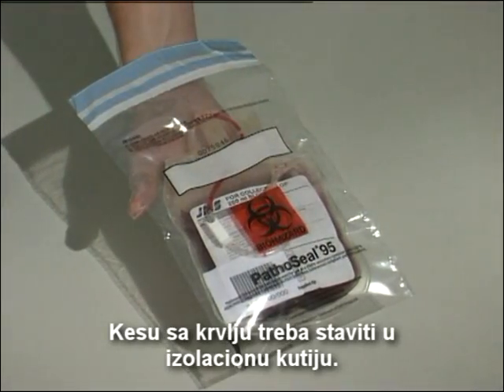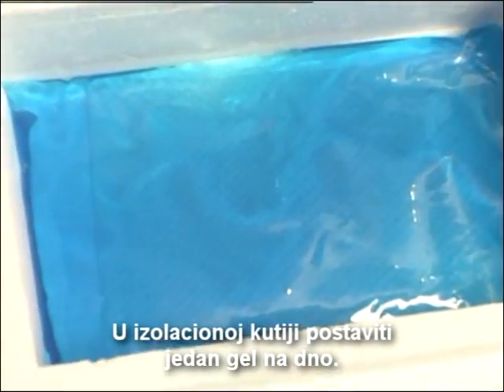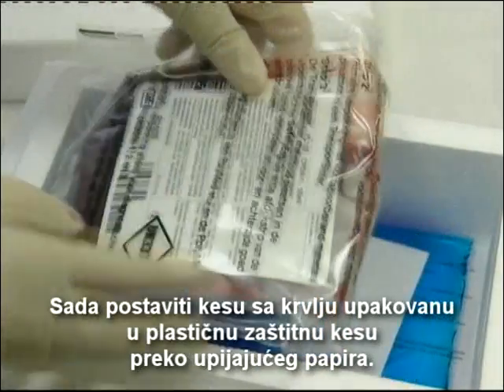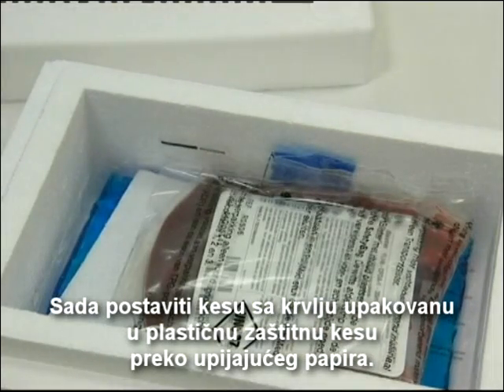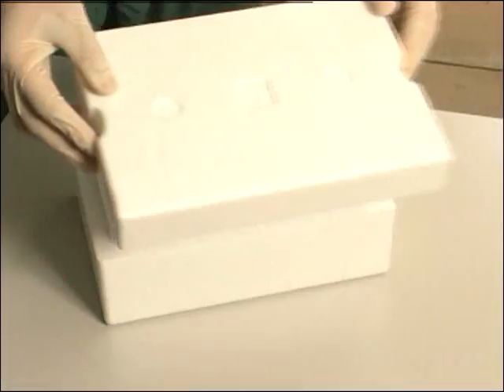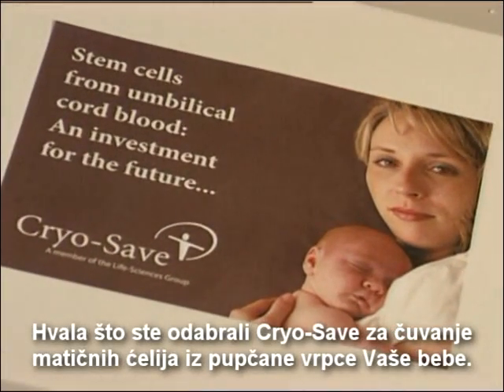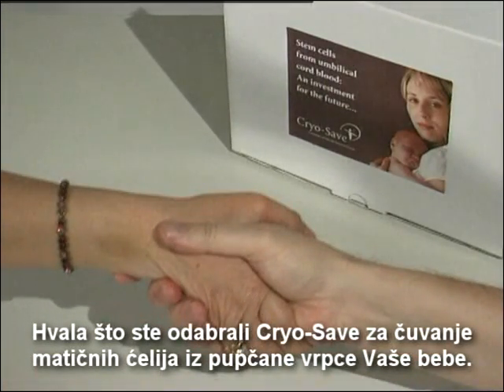The blood bag should be put in the isolation box. The isolation box should contain one gel pack placed on the bottom. The absorbing paper should be put directly on top of the gel pack. Now place the blood bag packed in the plastic safety bag on top of the absorbing paper. The second gel pack, kept at room temperature, should be put immediately on top of the blood bag. Close the isolation box with the lid. Thank you for choosing CryoSave to preserve your baby's umbilical cord blood stem cells.